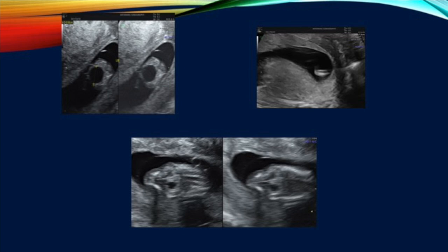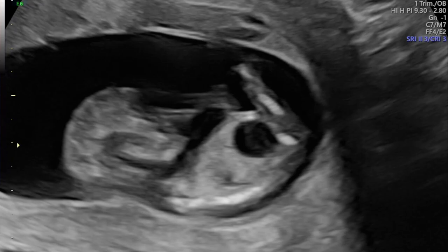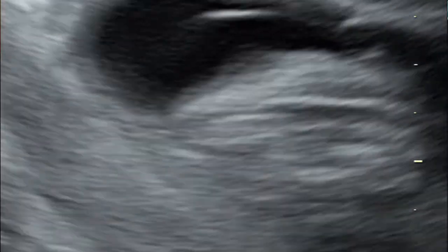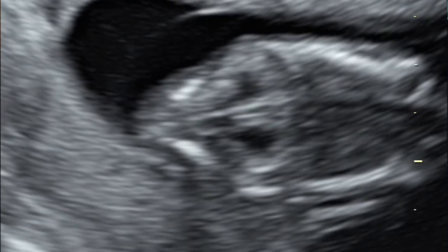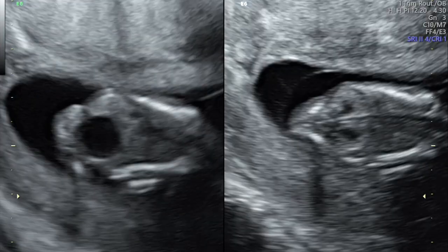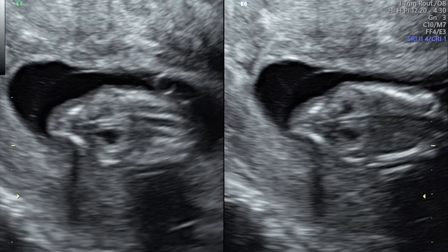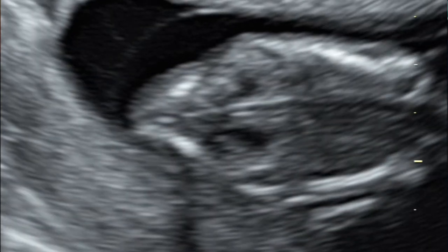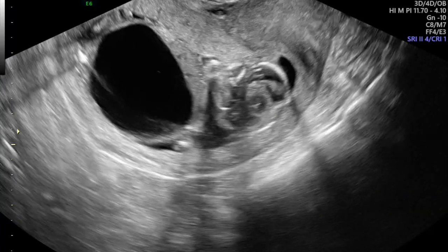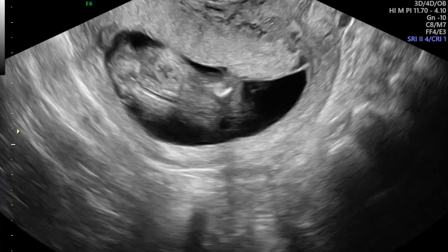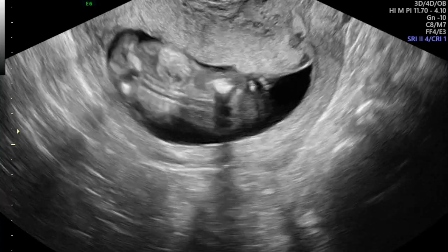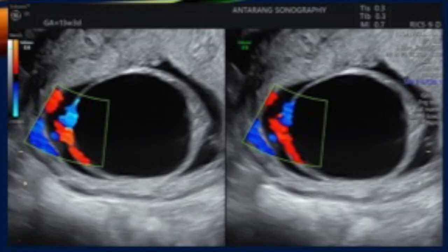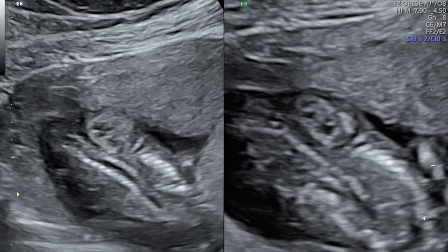Here is a 13-week fetus where you can see a very prominent bladder — the bladder diameter measured around 9.3 mm. The kidneys are very prominent, the pelvicalyceal system is prominent, the cortex is echogenic, and you can also see the dilated ureter. This is another fetus of around 13 weeks showing a typically dilated, distended urinary bladder.